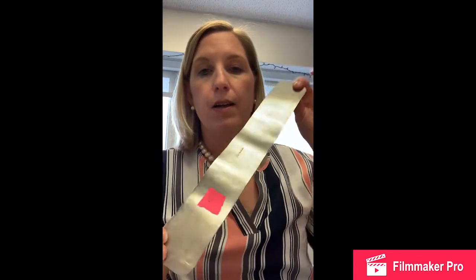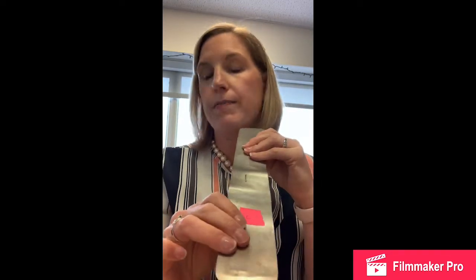The next instrument was this. Many of you should have gotten this. This is a handheld malleable. This malleable also comes in very, very narrow. Some people call that a ribbon. It also comes in a much wider version as well. It's malleable because you can bend it the way that you want it. Sometimes people use this to hold down bowel while they're closing fascia. So it can be used to push down safely on bowel. You would not want to leave this in a belly, however. So anyway, narrow malleable. Letter D, our next instrument, is this instrument.